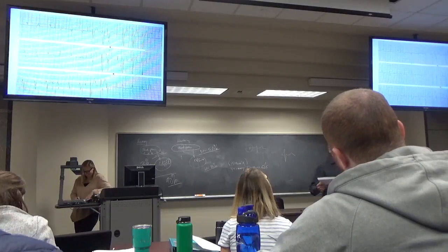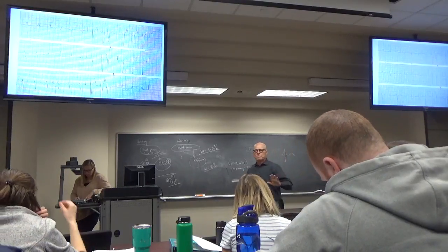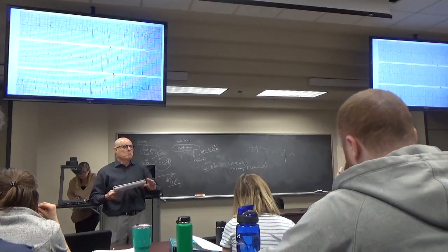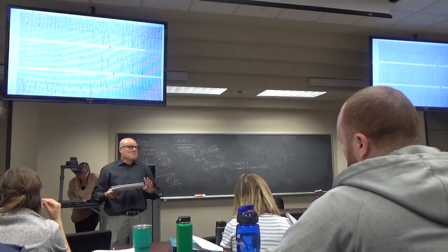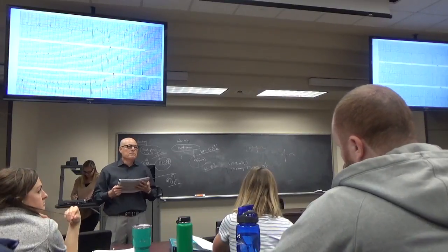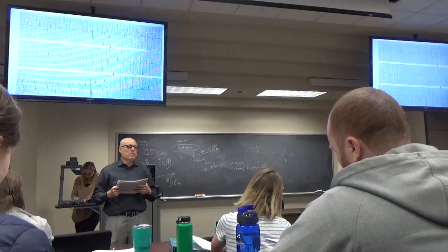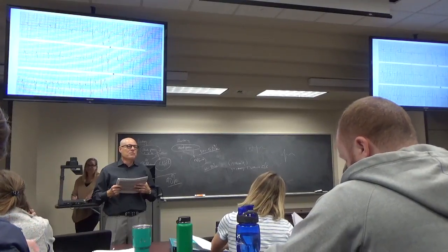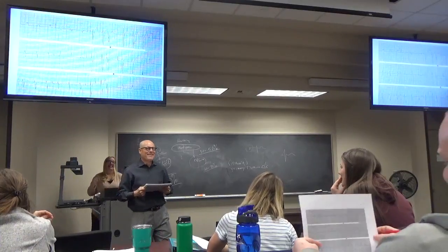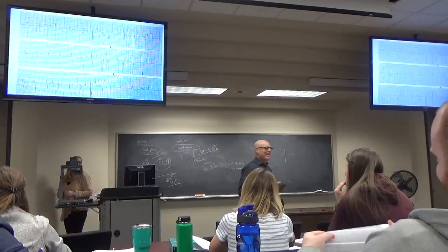So keep measuring the PRs. Don't beat yourself up if you missed it by 0.01. So it is greater than or equal to 0.2? Greater than or equal to 0.20. Okay, I thought it was just greater than. Yeah, I probably told you greater than 0.20. I changed the rule this morning because I called it first degree. See, I don't sweat it. I changed the rule then.